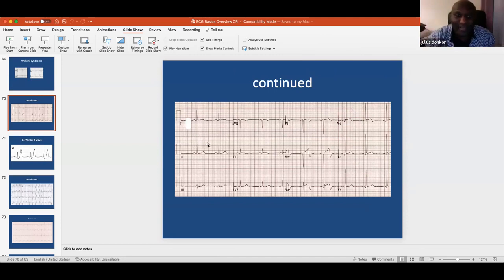So we can look up stuff like that, how to do differential diagnosis of early repolarization and pericarditis and various sort of things. Also, juvenile T wave inversion: juveniles tend to have T wave inversion from V1 to V3. So that's another differential diagnosis. And the T wave has particular characteristics, whether it's symmetrically inverted or asymmetrically inverted.